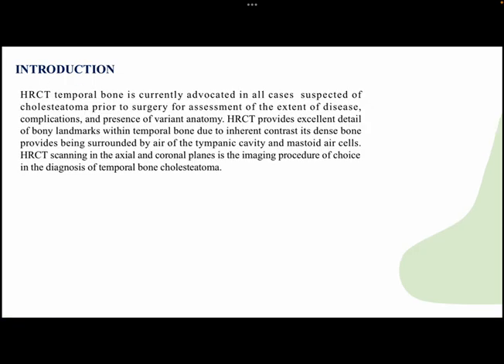HRCT temporal bone is currently advocated in all cases suspected of cholesteatoma prior to surgery for assessment of the extent of disease, complications, and presence of variant anatomy. HRCT provides excellent detail of bony landmarks within the temporal bone due to inherent contrast, the dense bone being surrounded by air of the tympanic cavity and mastoid air cells. HRCT scanning in the axial and coronal planes is the imaging procedure of choice in the diagnosis of temporal bone cholesteatoma.